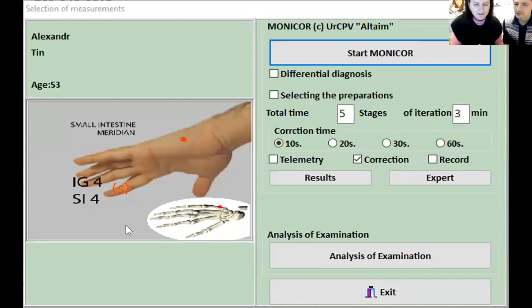Can you go back to just see that screen? Does it say the left hand, or does it always come up? Yeah, now it says yes. It's sinistra. There is sinistra, it's left. Dextra will be D. Oh, okay. So S equals left. And the other one is D, Dextra. Yeah, this is Latin. D is right. In the photo, you can tell that's a left hand just by looking at the picture. Oh, so you're more clever than I am.